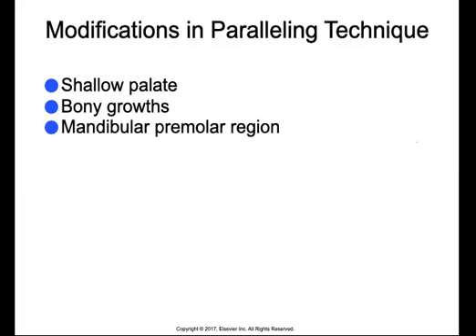Wanted to go over something really quick. If your patient isn't still during exposure, especially if you have a small child or somebody that's fidgety, this will result in a blurred image. And that's not really a diagnostic image and something that would need to be retaken. And you'll be surprised at how many people don't realize that you actually need to be extremely still for x-rays. So just make sure that you remind them in a gentle, friendly way, of course.